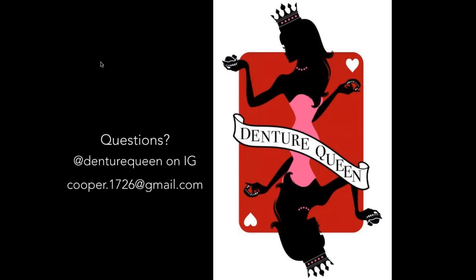The price difference between digital dentures and conventionally processed. Absolutely, there is a price difference. The digital dentures, I would say in general, are right now more costly than conventionally processed. And that's because it is time intensive in order to design all of the setup as well as the festooning. So when you have a try-in, it is more costly than having a conventional wax base with digital teeth on it.